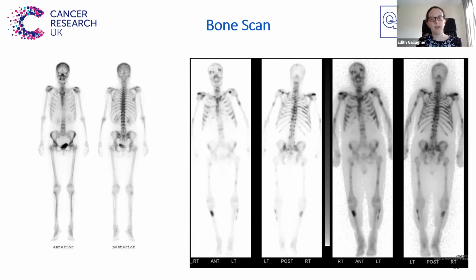All bones are repairing themselves all the time, but when they are damaged, the repair is much more obvious and appears as a hotspot or darker patch on the scan. For the purpose of this talk, I've taken 2 very contrasting images, but you remember I mentioned my patient who fell in the bath. The image might show the only hot areas on the ribs, which are repairing from the fall. Therefore, it is important to know the patient's history so that the radiologist can accurately report the scan.